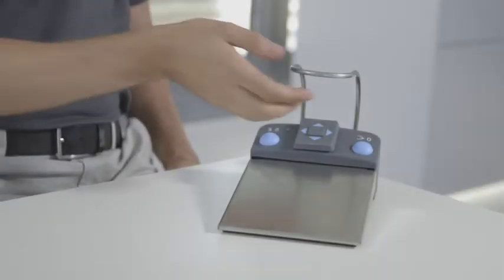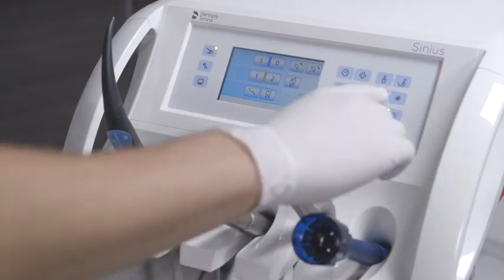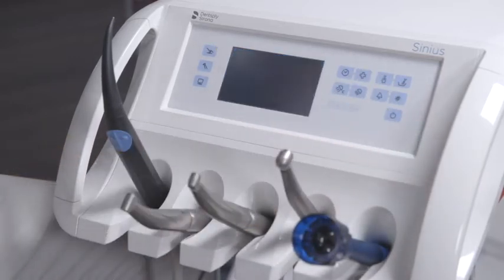In this video, we show you how to change the battery in the foot control. The system detects a low battery and reports it to the user interface of the dentist element. Switch the treatment center off at the main switch on the dentist element before changing the battery, so no unwanted functions are triggered.